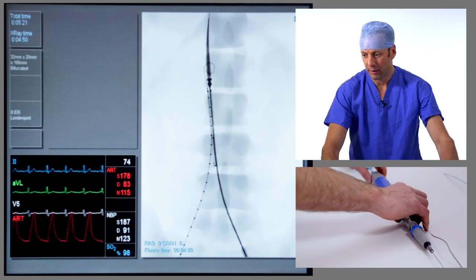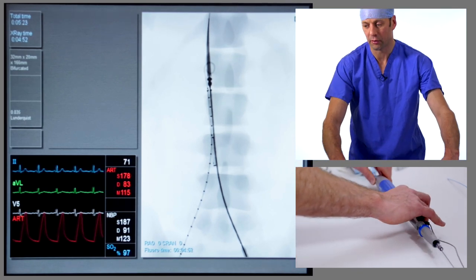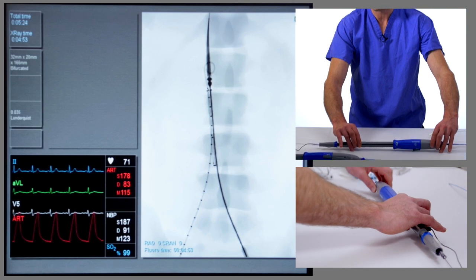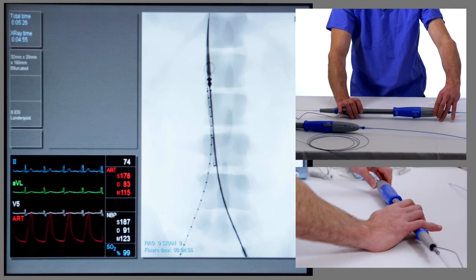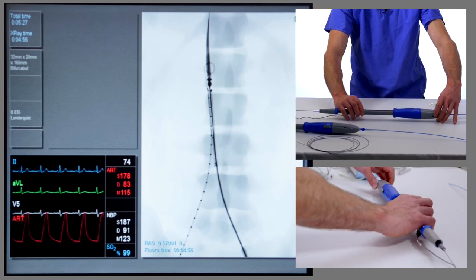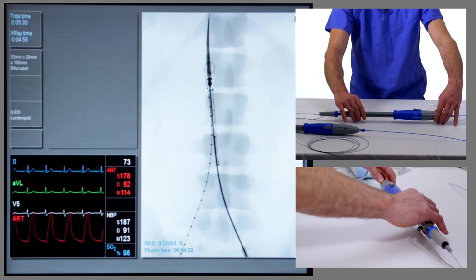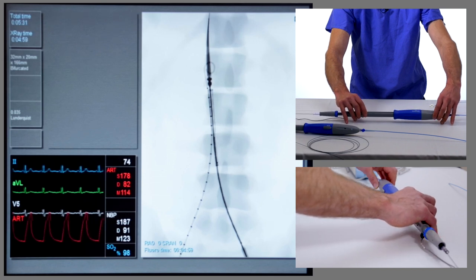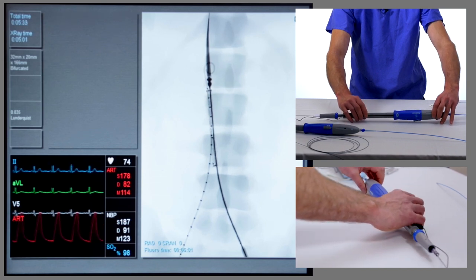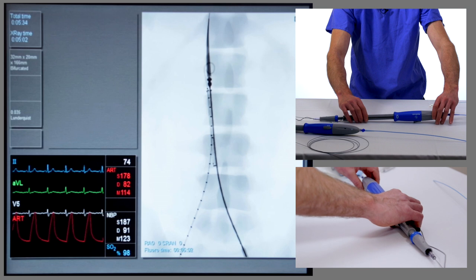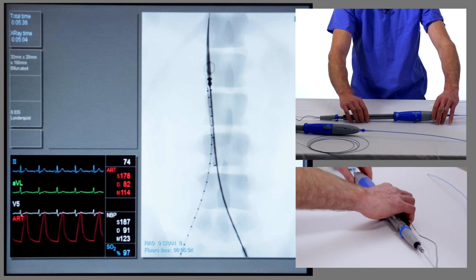We need to correct for the rotation, so we need the contralateral limb gate to open up towards the patient's right hand side. On the screen you can see it pointing to the left, and we're now going to rotate it through 180 degrees so the contralateral limb is pointing to the patient's right.